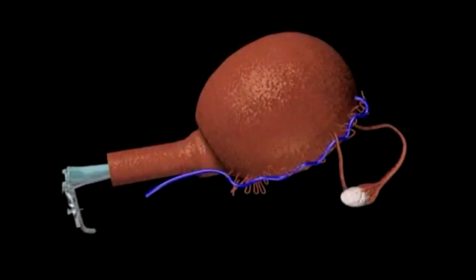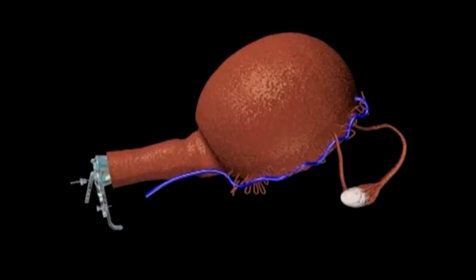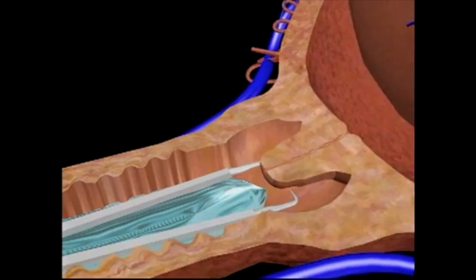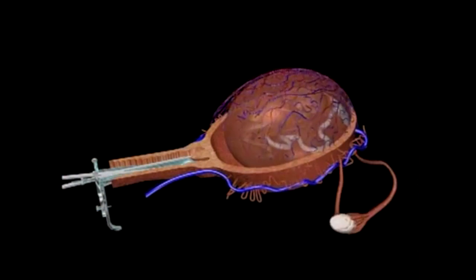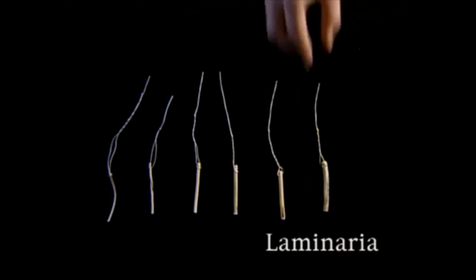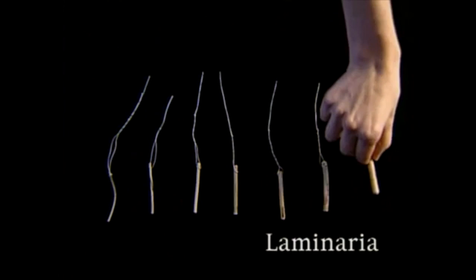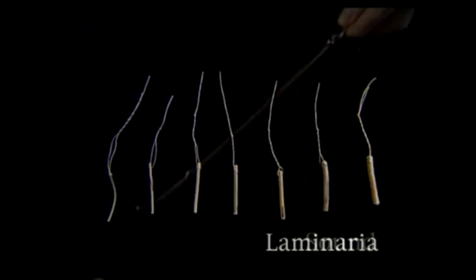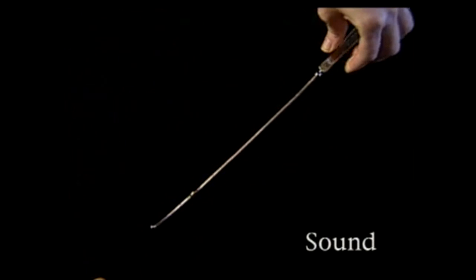On the first day, the patient's vaginal opening is enlarged through the use of a speculum. Then a tenaculum is locked onto the cervix and pulled until the uterus is brought in line with the vaginal canal. Next, the cervical dilation process begins with the insertion of a compressed seaweed product called laminaria. Before insertion, and it's not unusual for more than 1 laminaria stick to be inserted at a time, the depth of the cervical canal is measured with a thin metal rod called a sound.